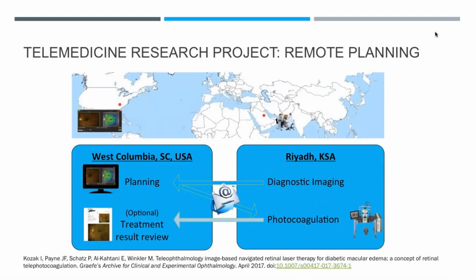Another application of retinal navigation is that it can be used in telemedicine. And telemedicine, or teleophthalmology, has become so important these days because of the worldwide epidemic and many of the consultations being turned into remote consultations. This is a proof of concept of how navigation is essential in doing these telemedicine treatments.